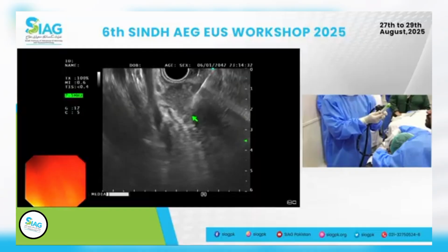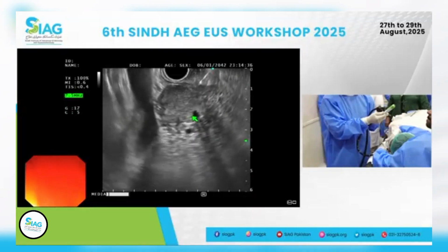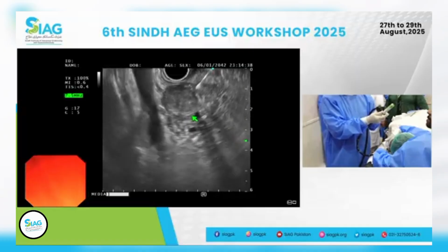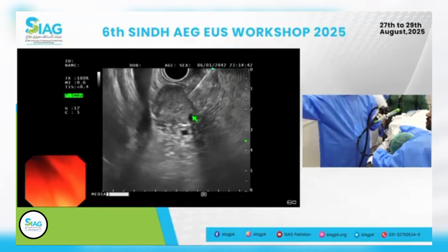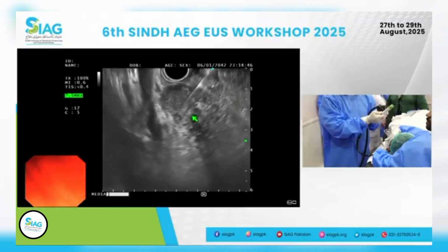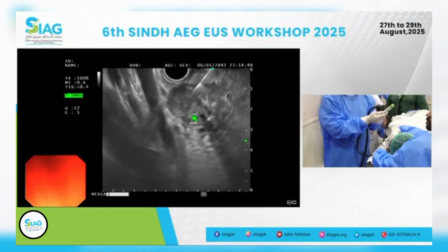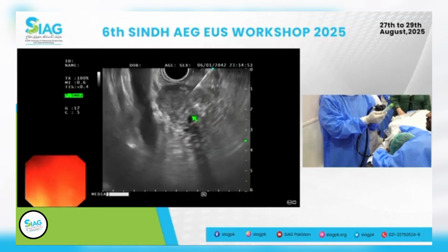Arif, there's a question or a point here. Doppler before inserting the needle. You can use it, but I literally don't see any major vessel in the way. Yeah, I think that's a good habit, but for your earlier stage, or when you started doing things, I think it's important to do it.